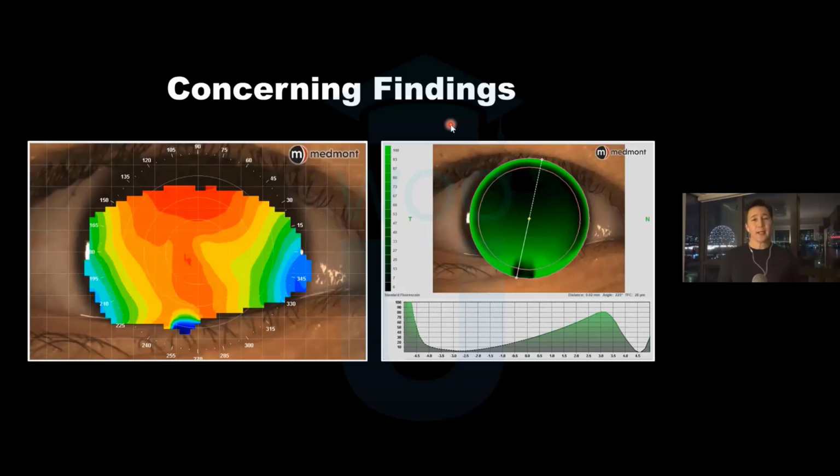Now, these kind of things can be helped. Certainly we have kids that have small fissures, and that can be a challenge to get them to open up wide. A few tricks that you can try are to pull down on the cheek. That's a way that you can open up the fissure. You can get that tear wedge off the lid margin. You can edit out these points here, and this is a very powerful thing because you get rid of the erroneous data before it goes into the WAVE software. So important things for us to do before we send data to the WAVE.